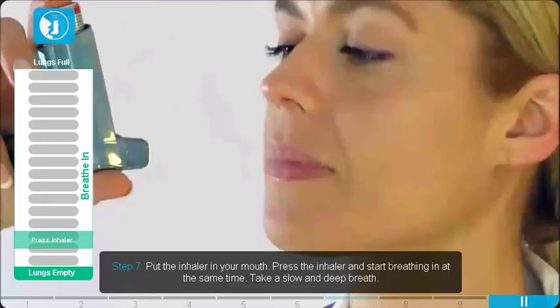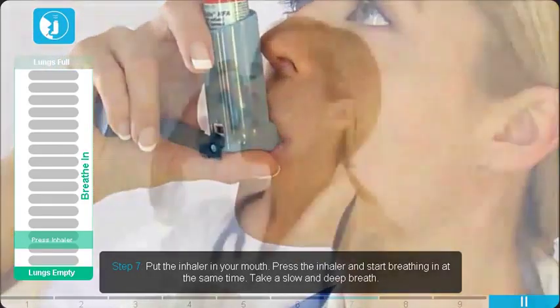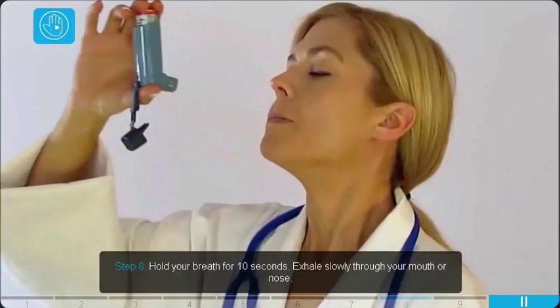Put the inhaler in your mouth. Press the inhaler and start breathing in at the same time. Take a slow and deep breath. Hold your breath for 10 seconds, then exhale slowly through your mouth or nose.